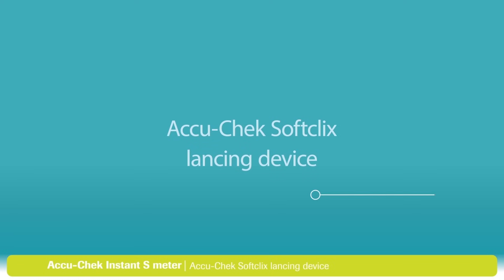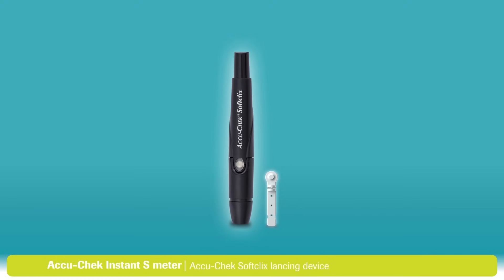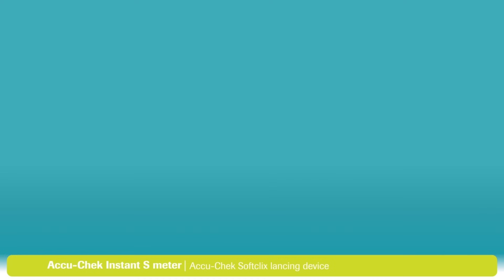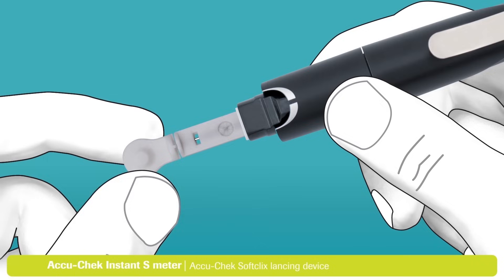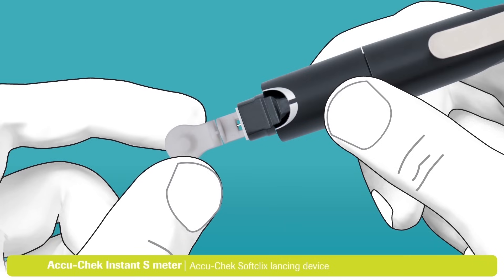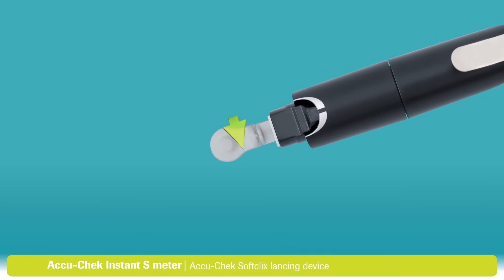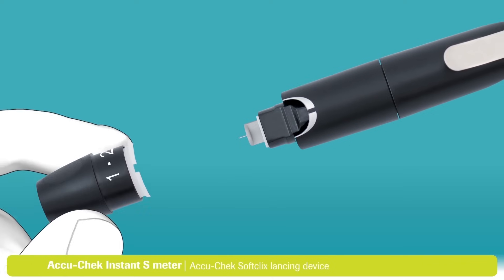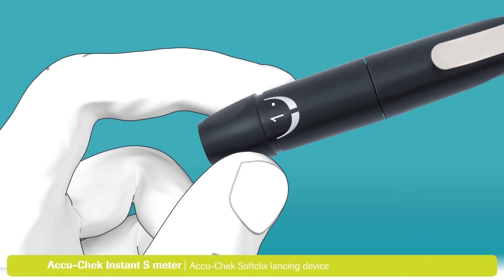Let's walk through setting up and using the AccuCheck SoftClicks lancing device. First, you will need to load your lancing device — for this, you will need an AccuCheck SoftClicks lancet. Remove the cap from the lancing device, then insert the lancet into the lancet holder and push it all the way in until it clicks in place. Twist and remove the protective cap from the lancet to expose the needle, then place the cap back on your lancing device, aligning the notch on the cap with the mark as shown.